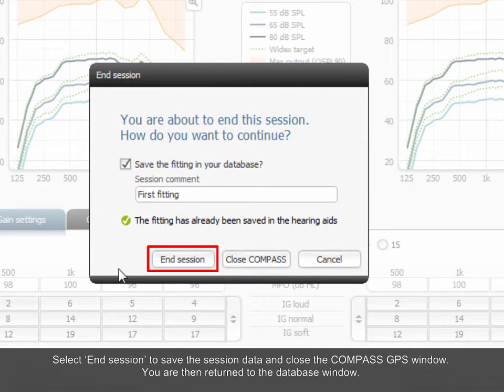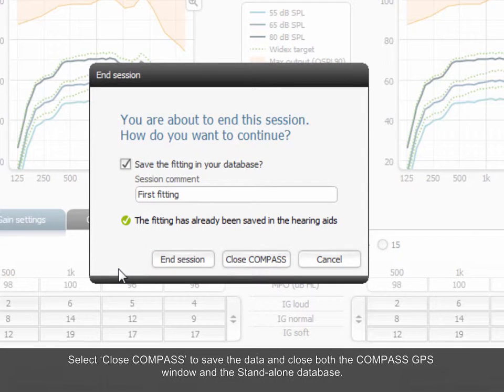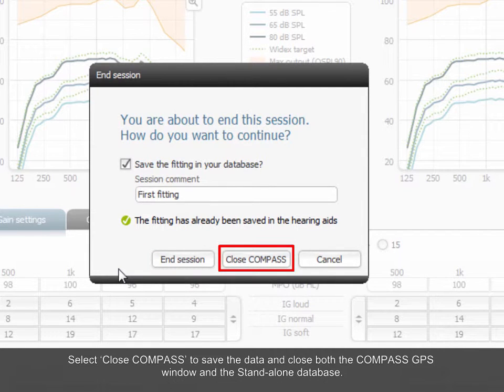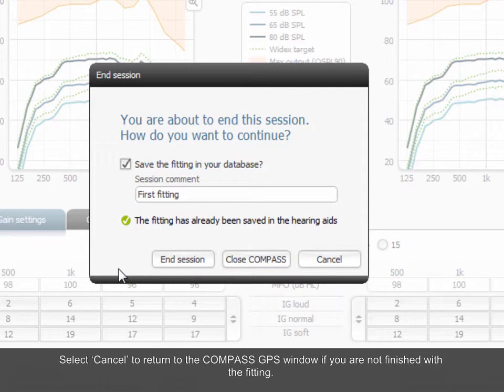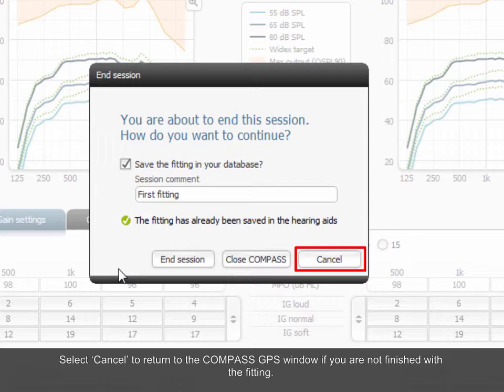You are then returned to the database window. Select Close Compass to save the data and close both the Compass GPS window and the standalone database. Select Cancel to return to the Compass GPS window if you are not finished with the fitting.